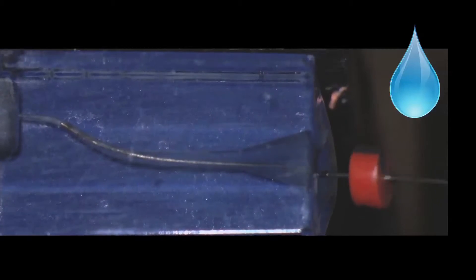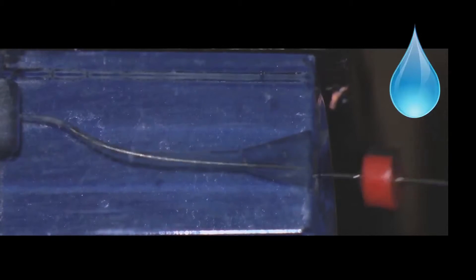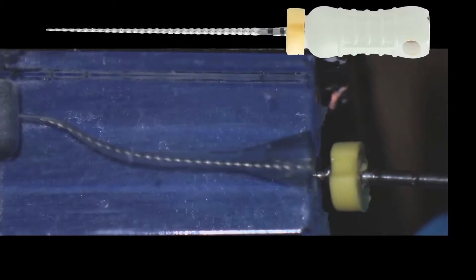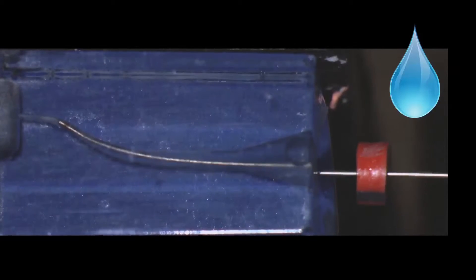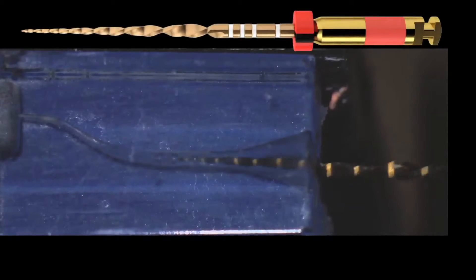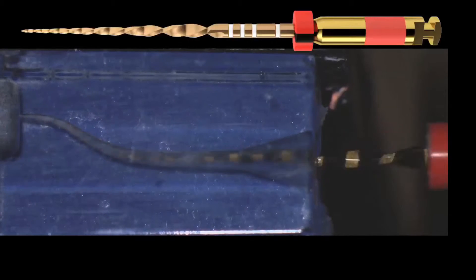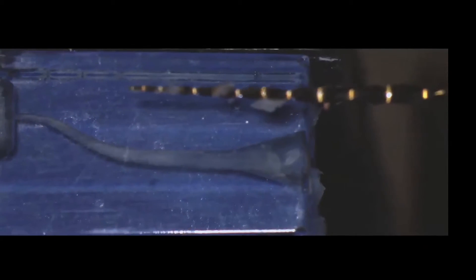We observe the instrument which has debris on it, clean the instrument, and go back even deeper with our irrigation needle. We irrigate and ascertain that the canal is still patent with the file that established working length. You can see the deeper penetration of our chemicals during root canal therapy with the side-vented irrigation needle. Now we will go all the way to working length with WaveOne Gold. As soon as the rubber stop touches the reference point, we don't need to continue reciprocating inside the canal.